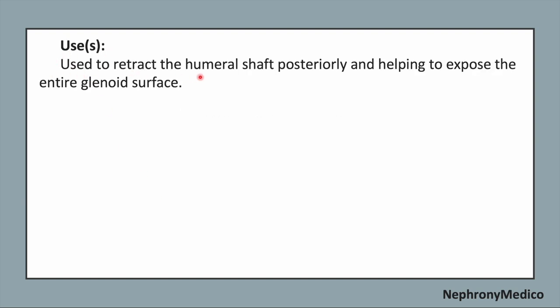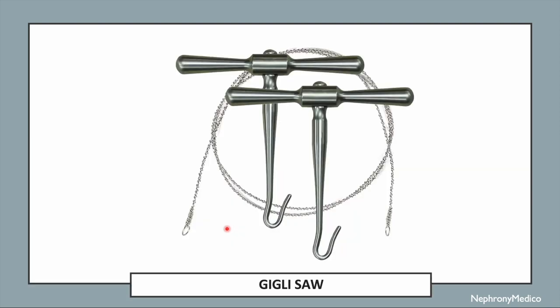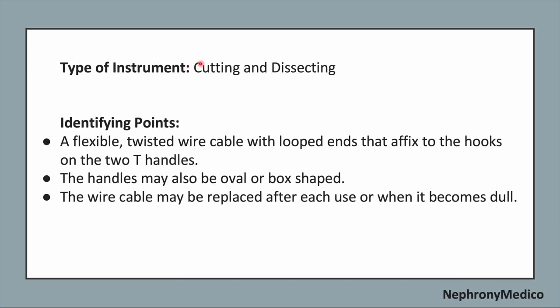It is used to retract the humeral shaft posteriorly and helping to expose the entire glenoid surface. Let's talk about Gigli Saw. This is a picture showing Gigli Saw. It is a cutting and dissecting type of instrument.